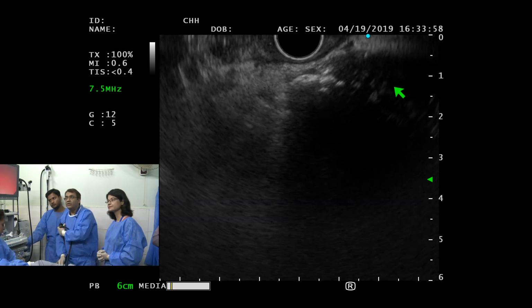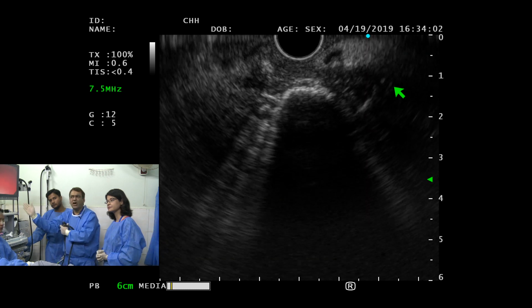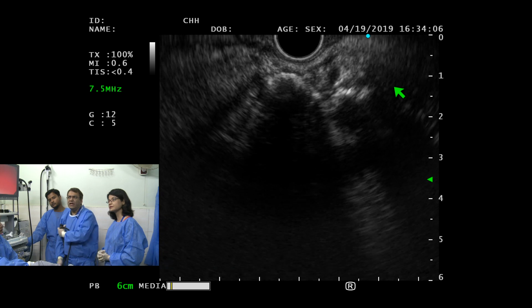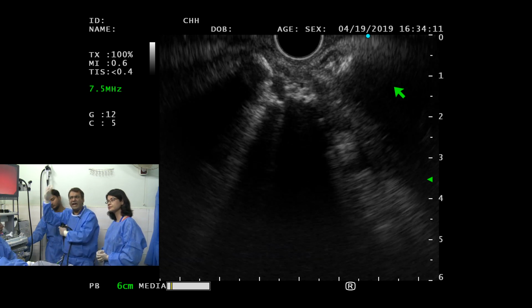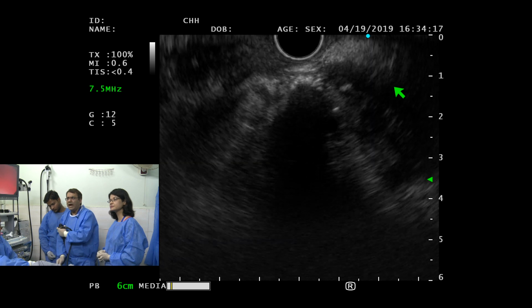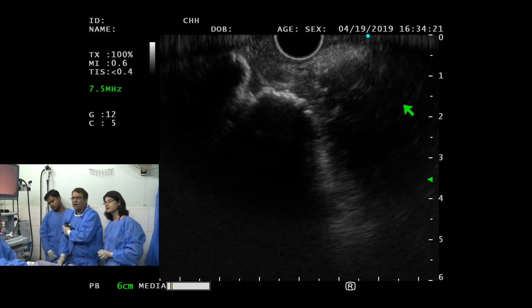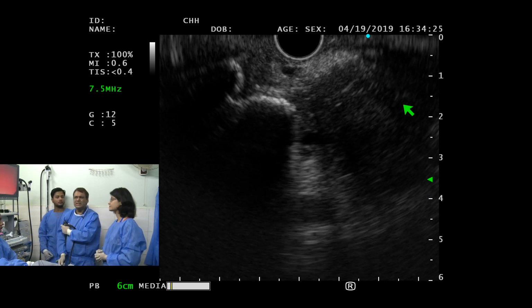Okay. So sometimes you have to pull it back, and it's all calcification all around. This is all inflammatory mass. Okay, this is all necrosis and inflammation there. I can't see anything there because it's a lining of calcification there. So I'll pull back a little bit. You see, this is the area, the neck area, what they're calling a mass. I'm surprised they didn't see the stones on CT scan.